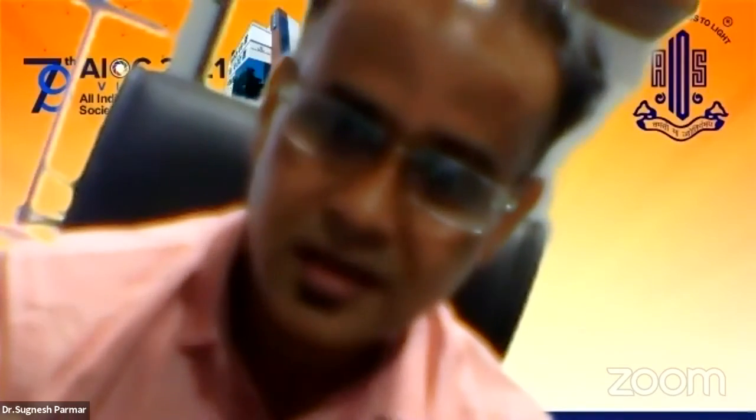I had one video available with me, which I did. There was a dislocated IOL, dislocated CTR, AC IOL, and total retinal detachment. I had to remove the anterior chamber IOL first, then I removed the IOL and CTR, and then I did the vitrectomy surgery for retinal detachment.